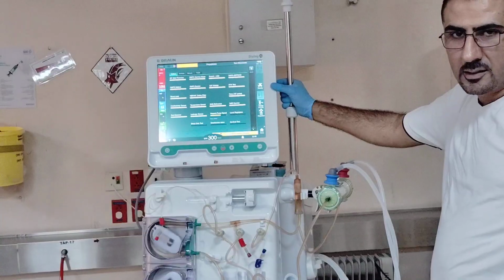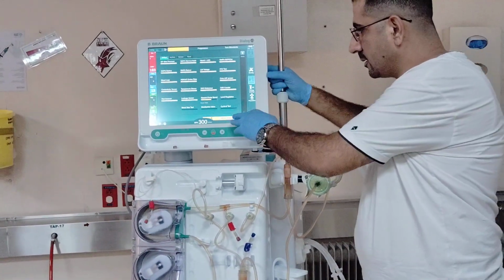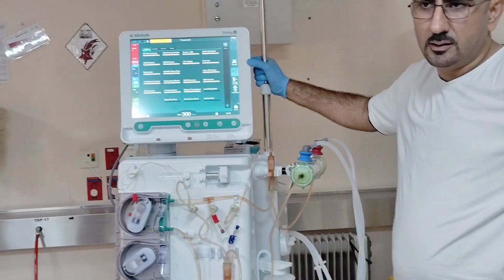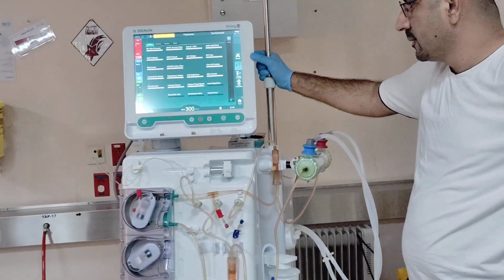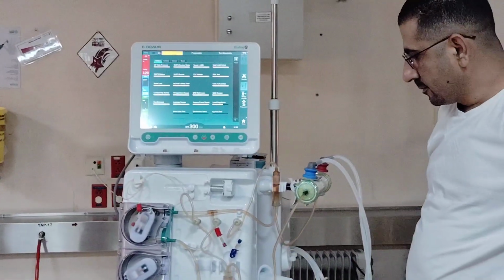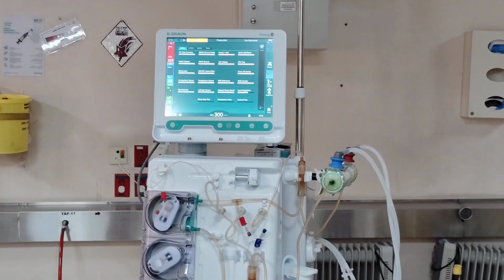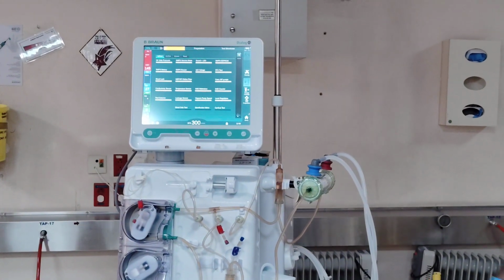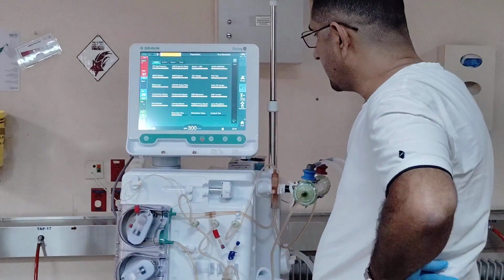Now because we are still in the preparation, the system gives you a warning. But in case we are in therapy, you will get an alarm and the level regulation. Okay. Now the last thing is the blood side test.